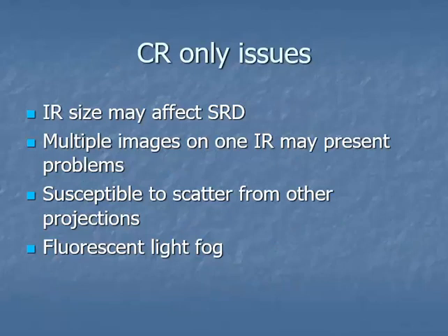CR only issues, we have certain issues just related to CR. So image size may affect sharpness of reported detail in the CR cassettes or CR plates. Some of your manufacturers made their plates based on one image matrix size or one CR matrix size.